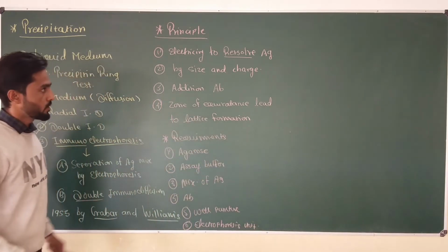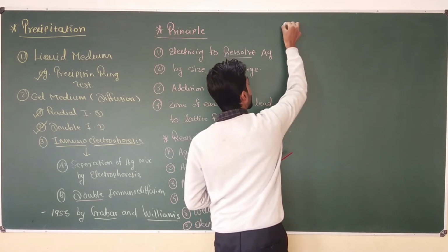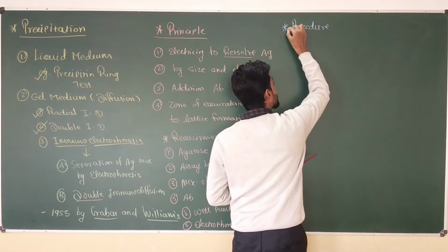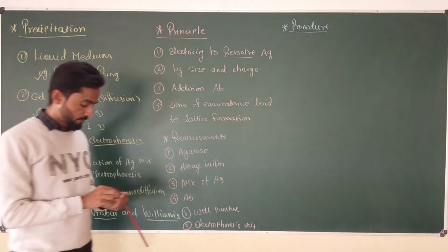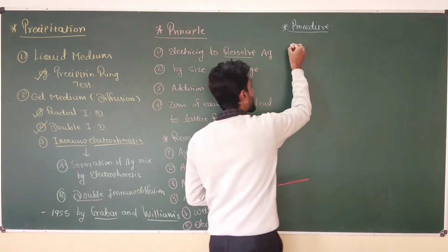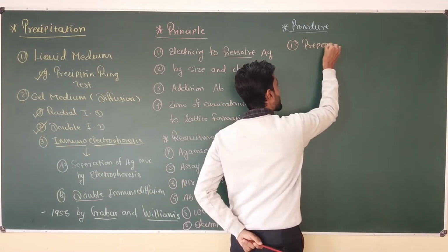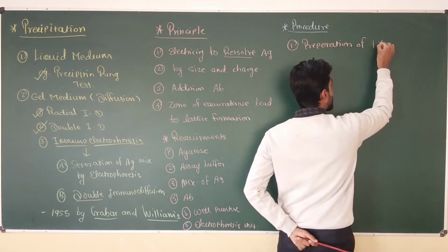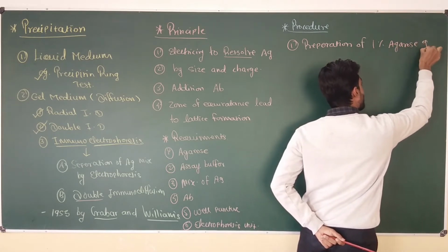Now I'm going to discuss the procedure of this test, that is immunoelectrophoresis. The first step is preparation of 1% agarose gel.